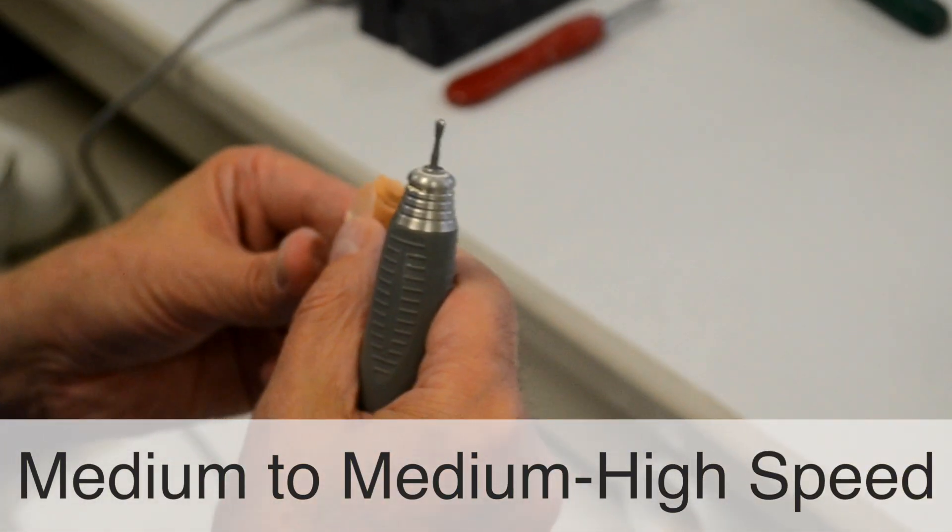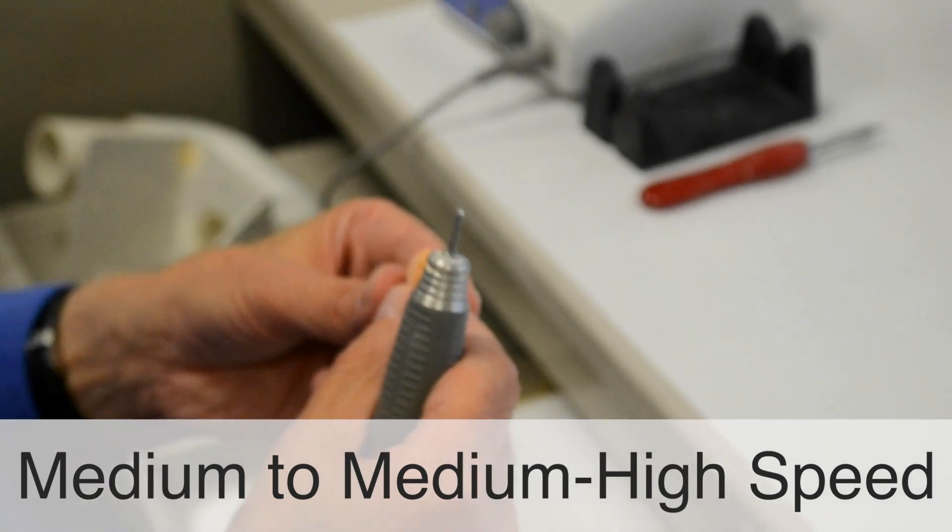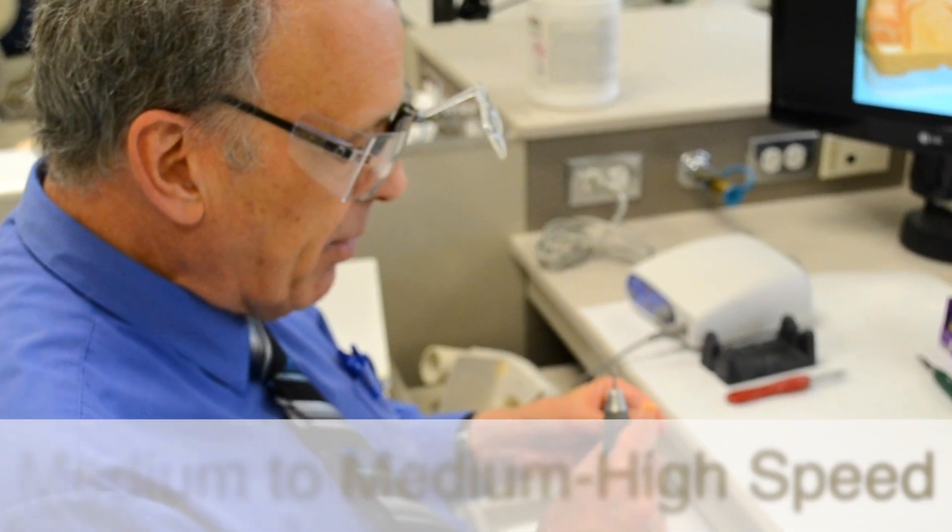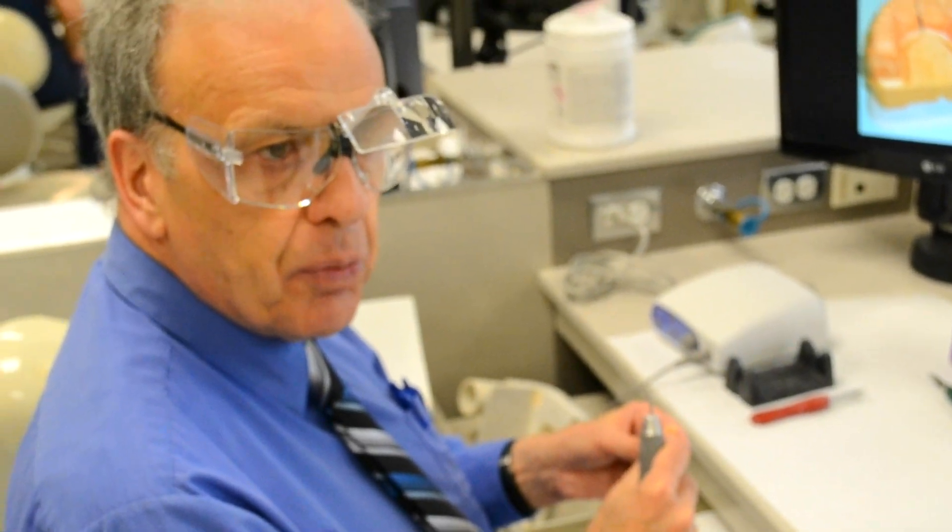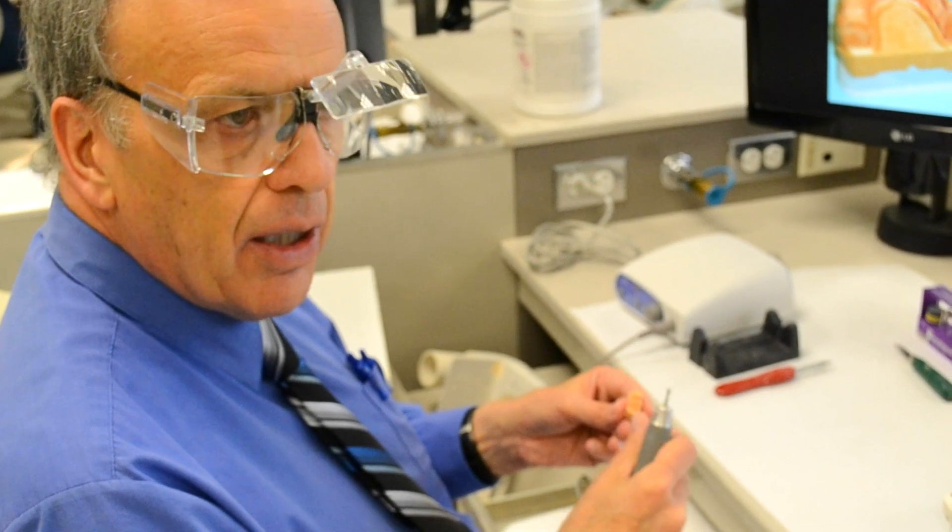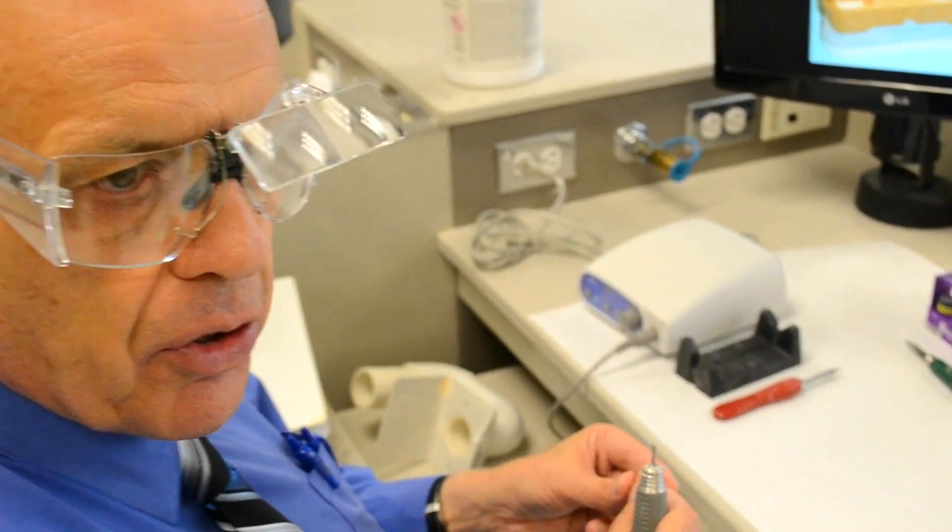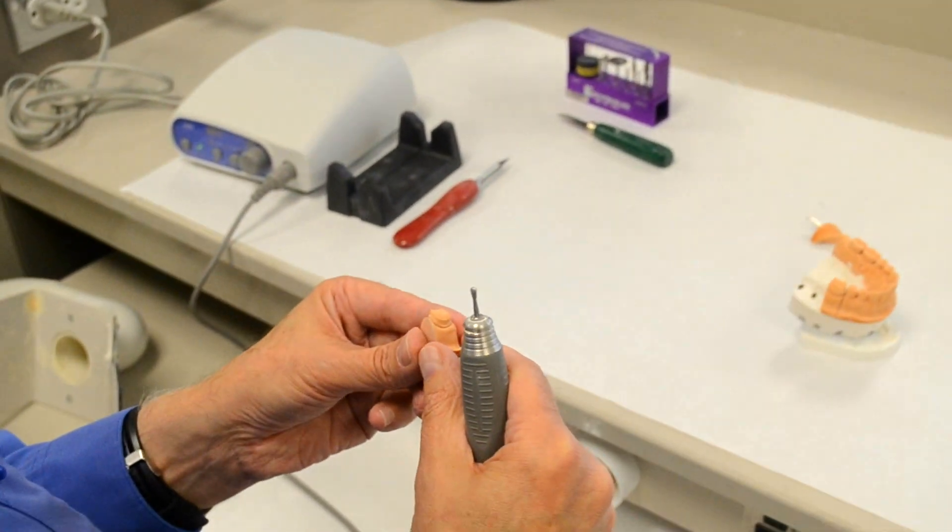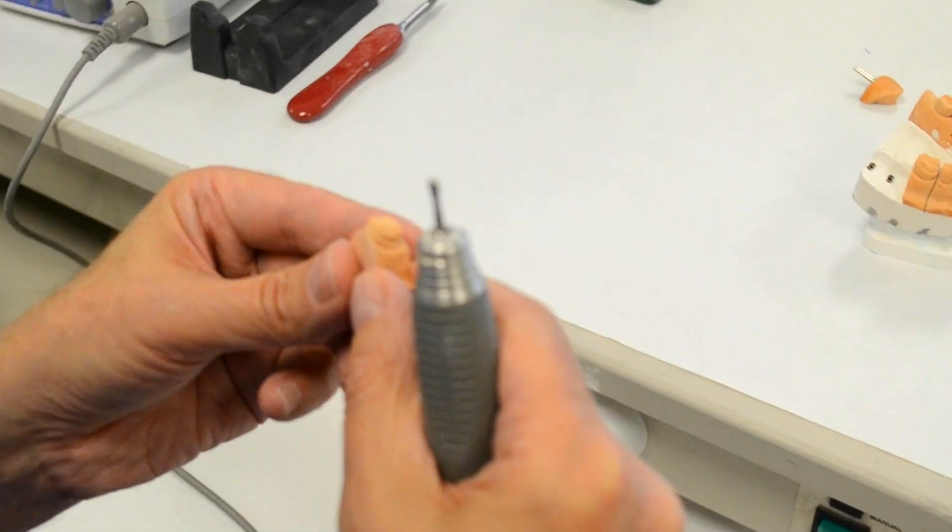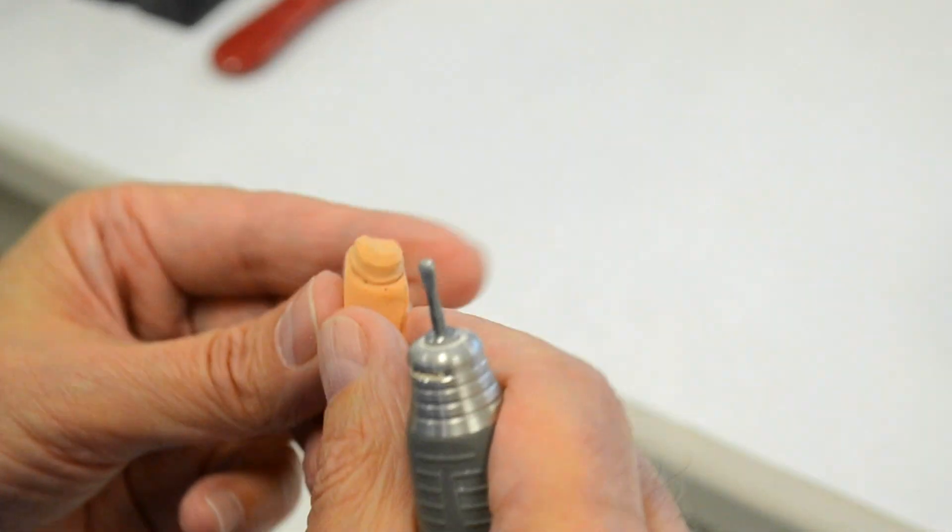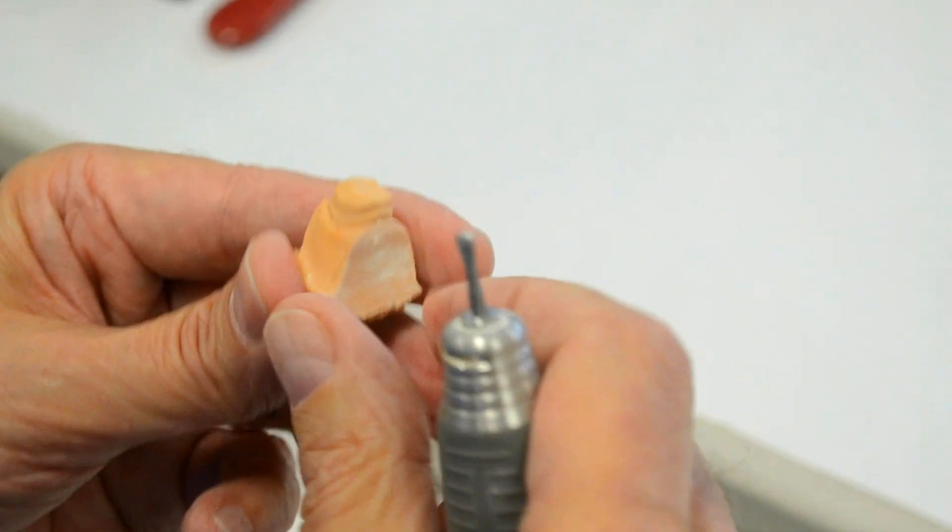When the burr rotates at a very low speed, there is a greater chance of the flutes grabbing onto or engaging the gypsum in the die and subsequently causing the burr to skip, which in turn can lead to damage to the die. So it's best to rotate the burr at medium or medium-high speed.